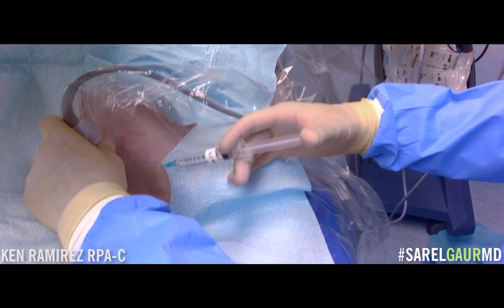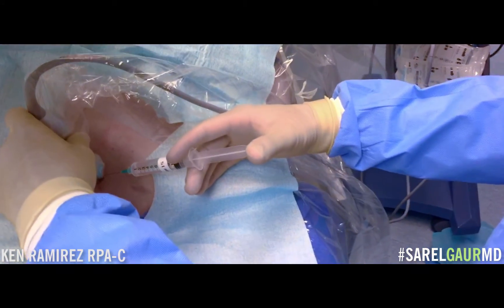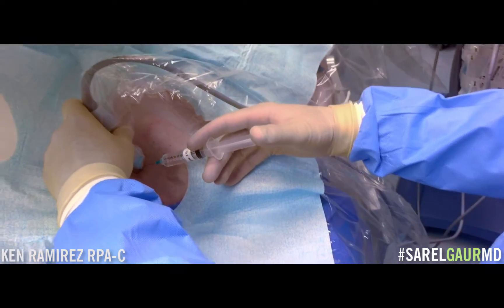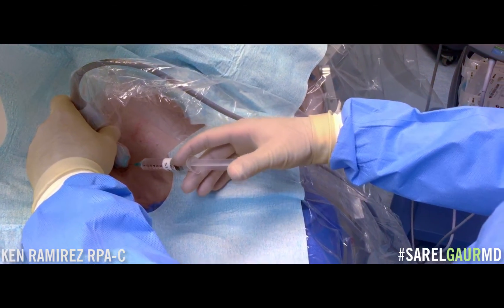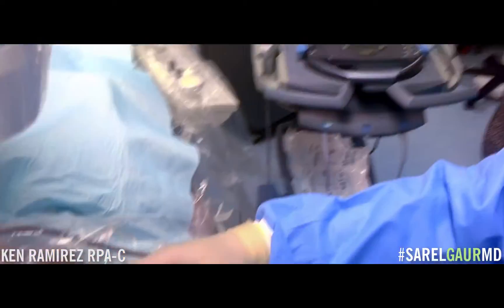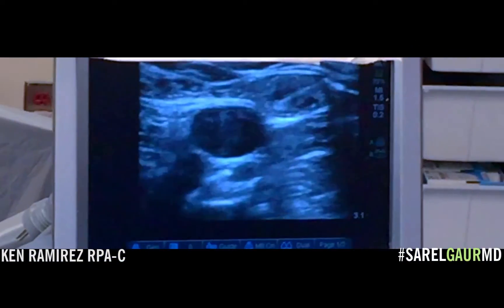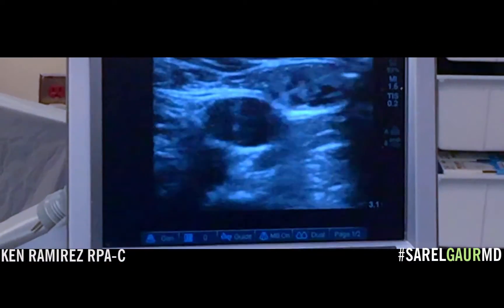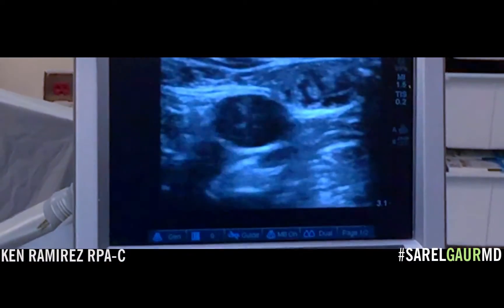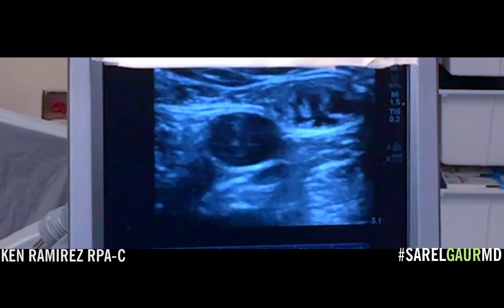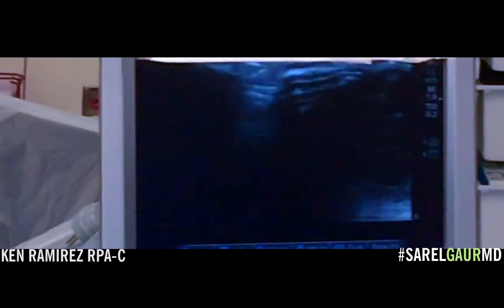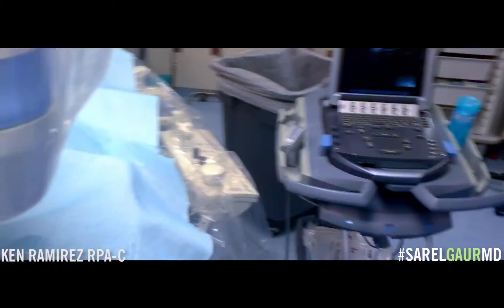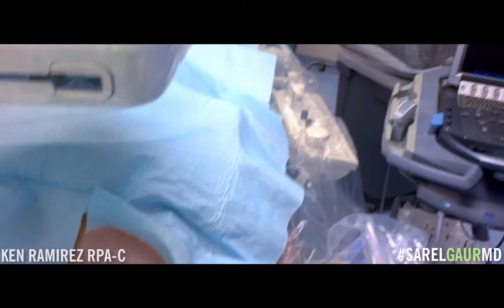You're going to feel a pinch, okay? A little pinch. So we'll go with live ultrasound and we're numbing the area. I'm just making a little wheal.